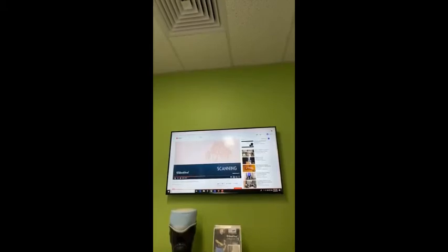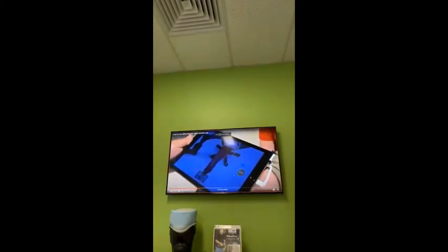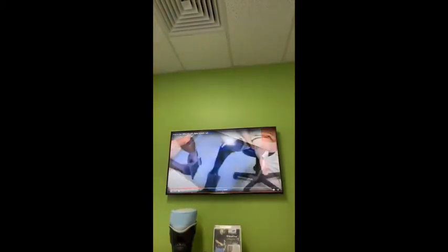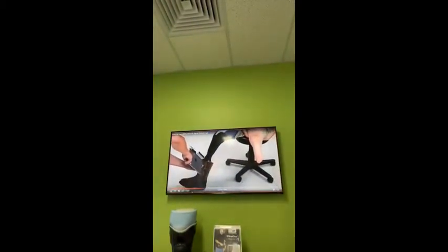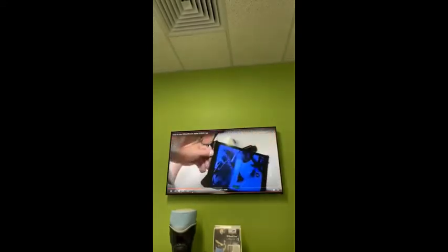So now we're ready to scan. Tap the green Start button on the screen. The shape will be covered in white on the screen as it is scanned. Move around the limb to capture the entire surface so that the limb is entirely covered in white on the screen.